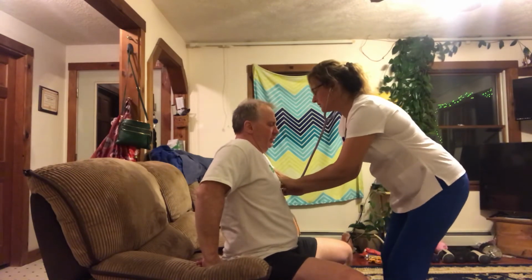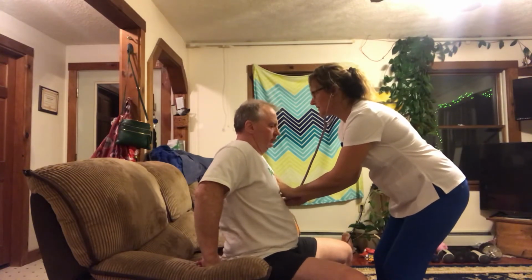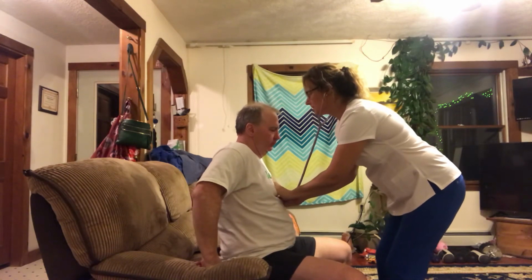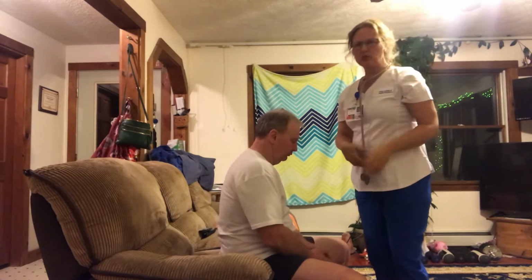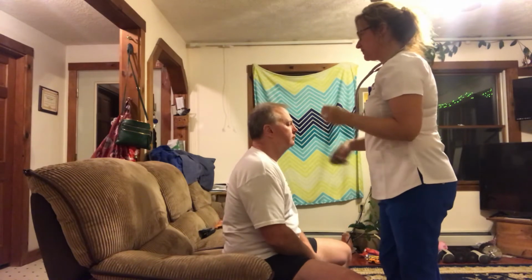Tricuspid, fourth intercostal on the left. And mitral, fifth intercostal on the left. All sounds are clear and normal. If the sounds were abnormal, you would use the bell of the stethoscope to listen further. All right, now I'm going to listen to the lungs.